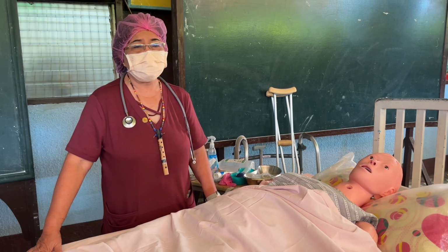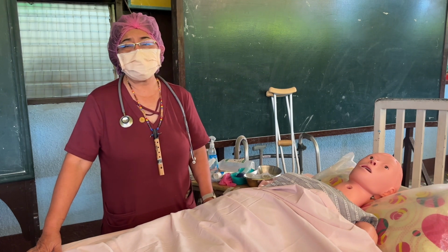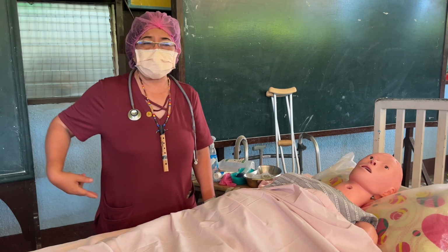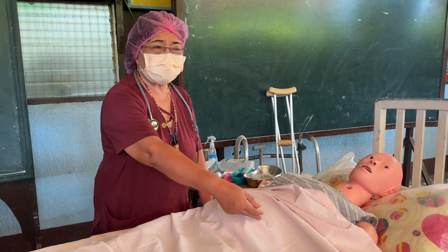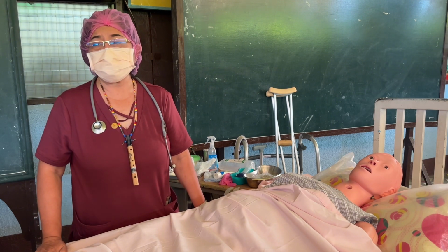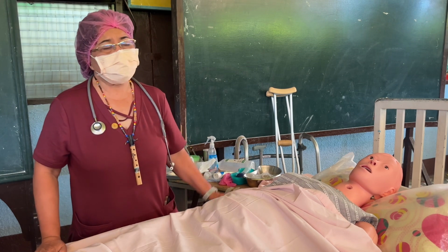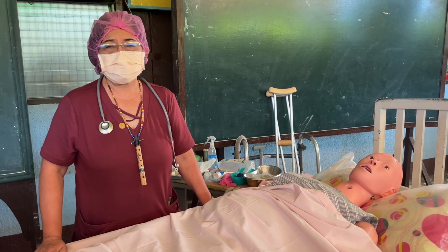This should be changed. In case of gavage, the safest way of feeding is through gastrostomy, the tube being inserted directly through the stomach, or jejunostomy, where the tube is inserted in the small intestine and feeding is directly pushed through the small intestine. There are lots of complications in NG insertion, that's why it has been discouraged.